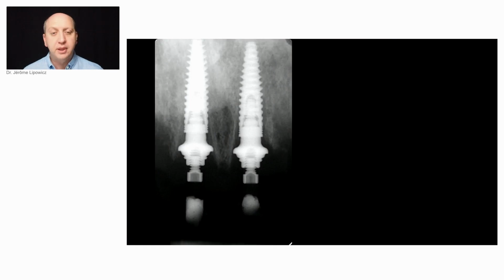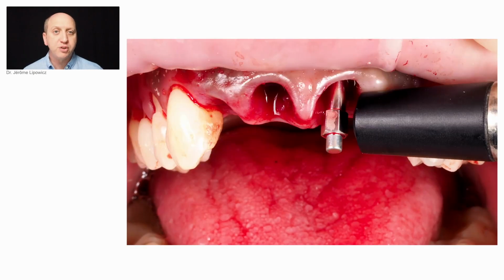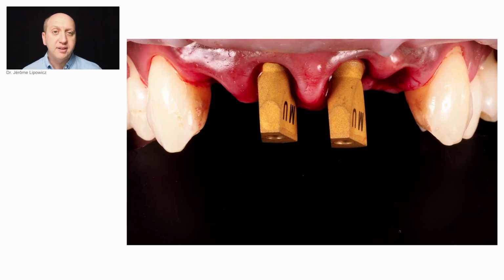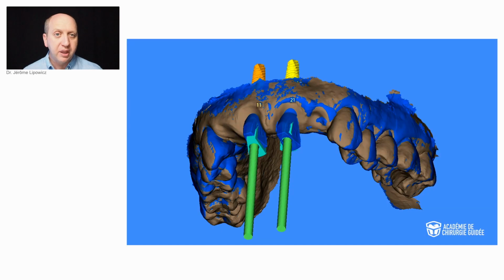We did obtain a high torque for each implant. There are parallels just as alike. We're doing the ISQ measurements. We got nice results. It's all green. I can collect many information on Odstel Connect, such like treatment details, the torque, the bone quality, the risk factor, the surgical protocol, etc.